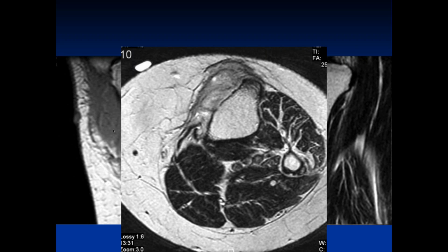Maybe a little cortical thinning there on the axial, and I see one area of cortical discontinuity right in there, but it's probably okay. The marrow space looks pristine, so it's not really locally aggressive or invasive. It's just expanding into the soft tissues. It's a little bit too high signal for some kind of fibroma. It could be a peripheral nerve tissue lesion, but it's put in the uncertain origin category because people still are arguing over the origin of this particular lesion.